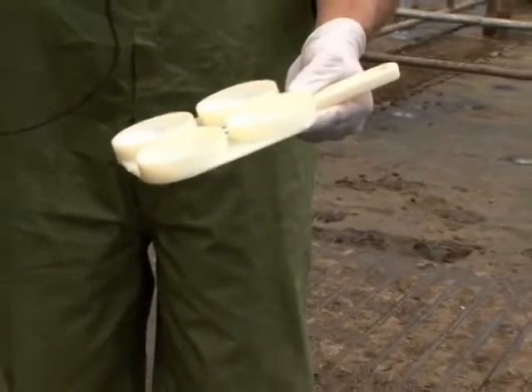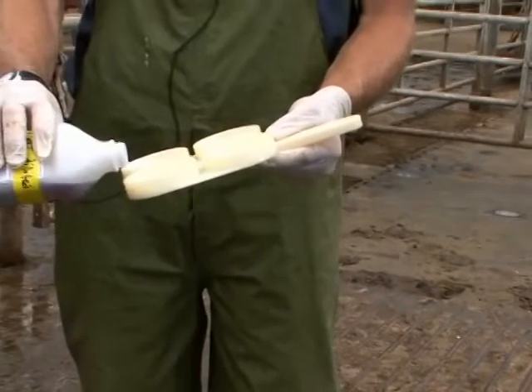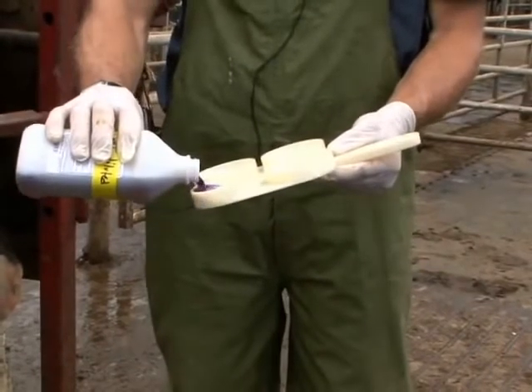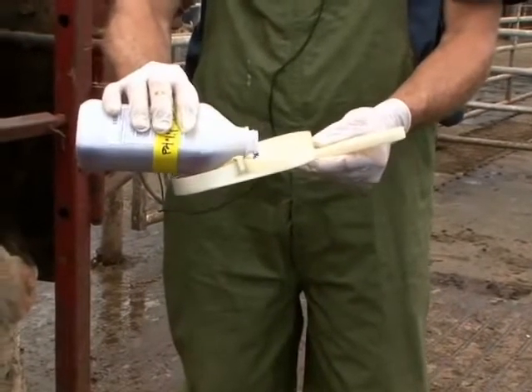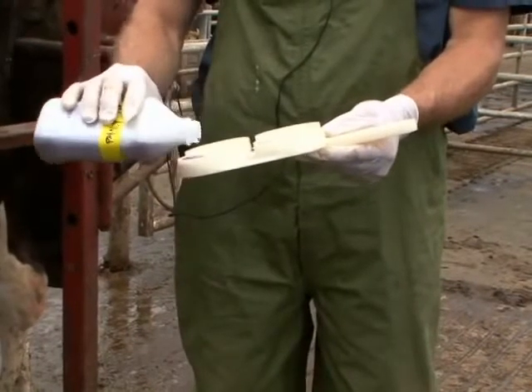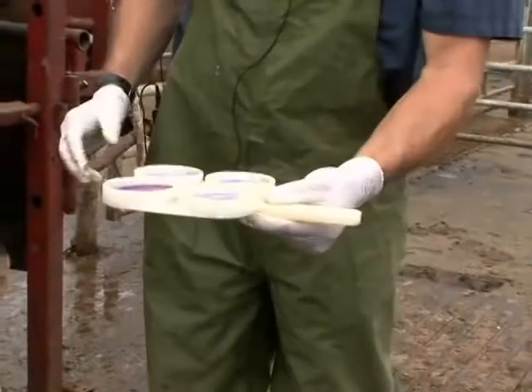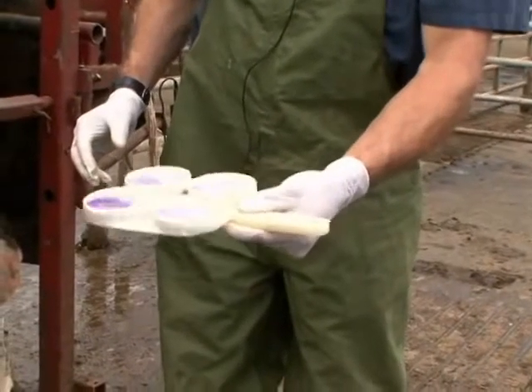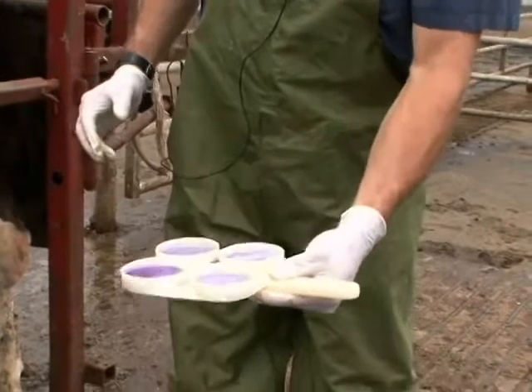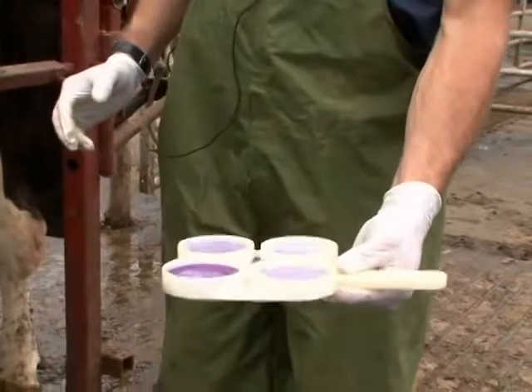And then we add an equal amount of reagent to milk per well. This isn't an exact measurement. It's cow side. We just try to guess or estimate how much milk is in each of these wells, and we add the reagent to each of these wells. And then once we have enough reagent in each, we rotate it and shake it and rock it back and forth until we get a complete mixture of the reagent with the milk.